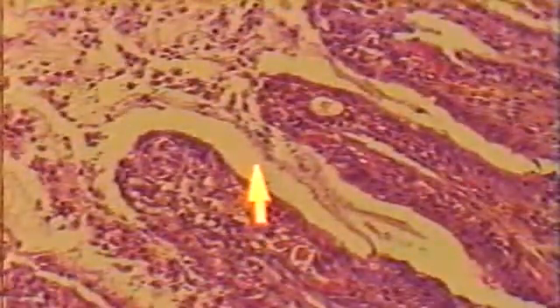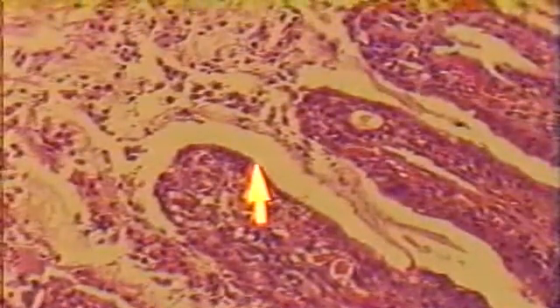Even at this magnification using the 20x objective, and even with the video system, you should be able to see that the surface of the intestinal cells appears rather serrated or very rough, and this is due to the presence of the Cryptosporidium parasite.